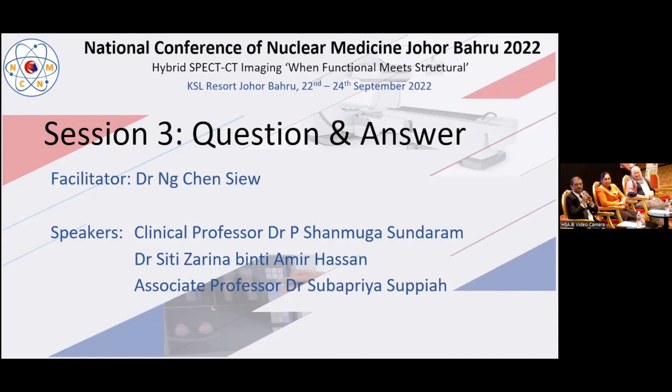In which patients do you think 4D CT is better than the other imaging? We were using 4D CT in patients where all nuclear medicine procedures have failed. The planar, the SPECT-CT, and the subtraction scan, everything is negative, but the PTH is more than 100 or 200, and you are unable to exactly localize it. You will go for a 4D CT.